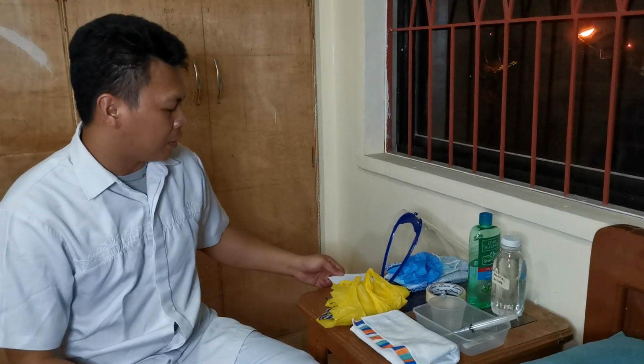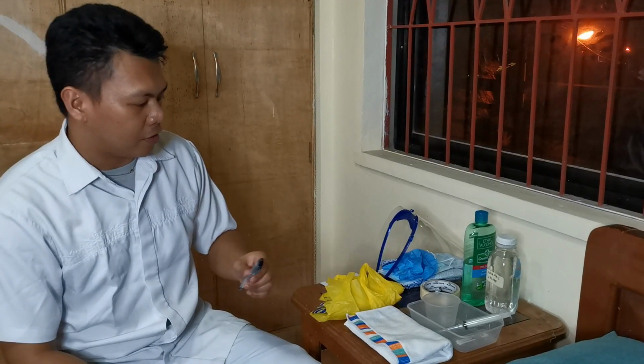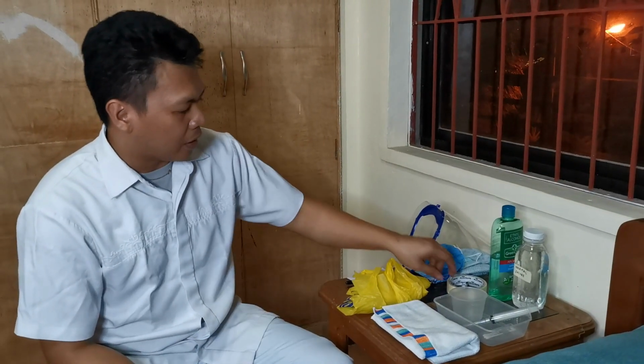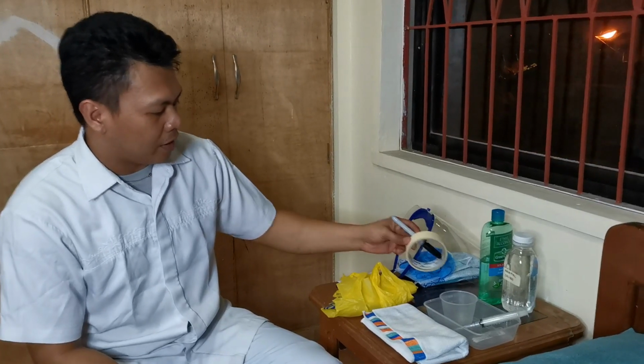And then you have your pen for documenting and writing the date on the dressing. Also, we have bandage tape. If you don't have the bandage tape, you can use any available tape in your house. And then we have our PPE composed of our face shield, our gloves. We have our mask and our apron or our gown. So those are the equipment needed for our procedure.